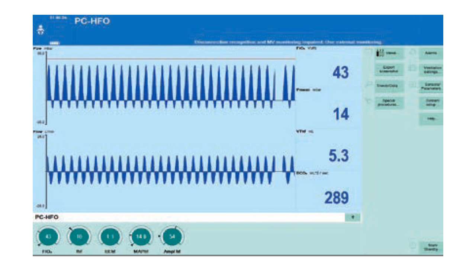This is the ventilator screen. You can see various parameters: at the bottom left, the FiO2 is about 43%; the frequency is set at 10 as discussed; the MAP being delivered is 14; and the amplitude is also displayed. You can dial any of these numbers up or down to achieve the proper saturation. There is also a number in the bottom right — 289 — which is the DCO2, which we'll discuss shortly.